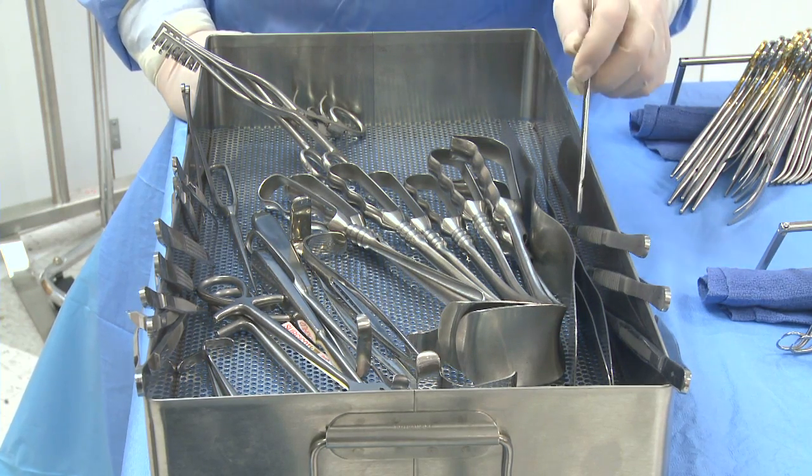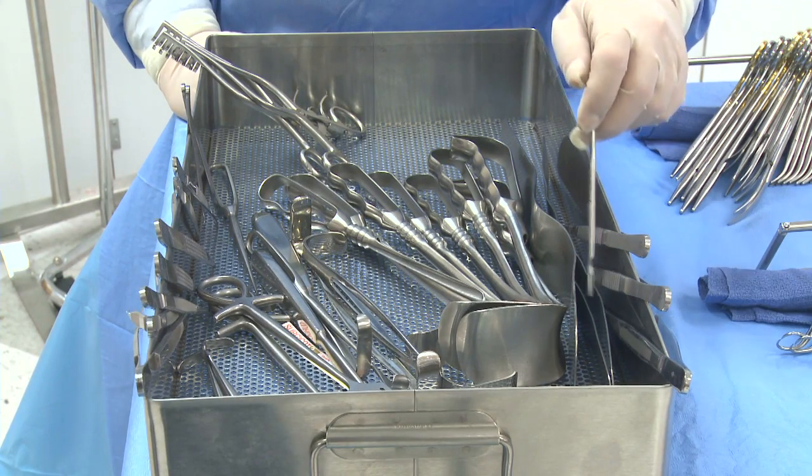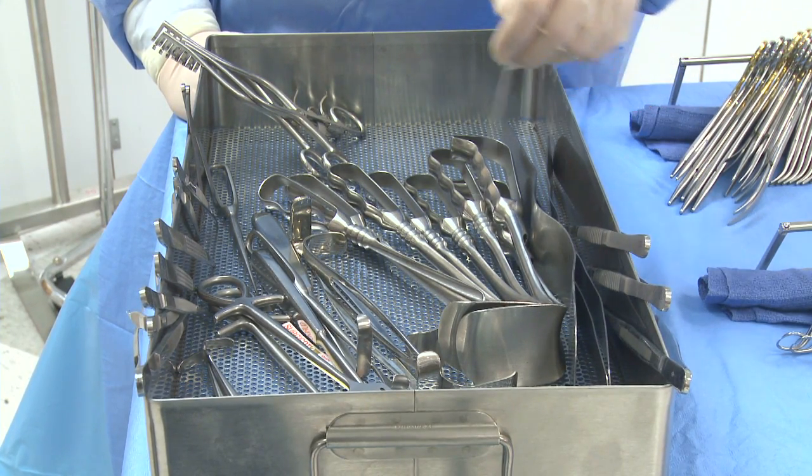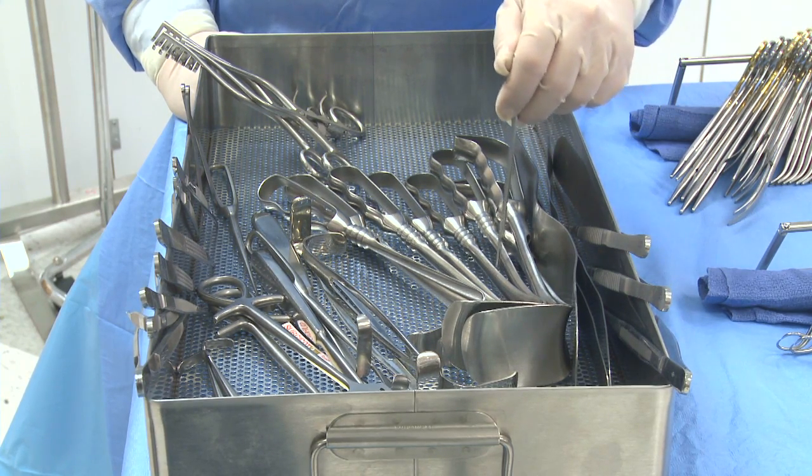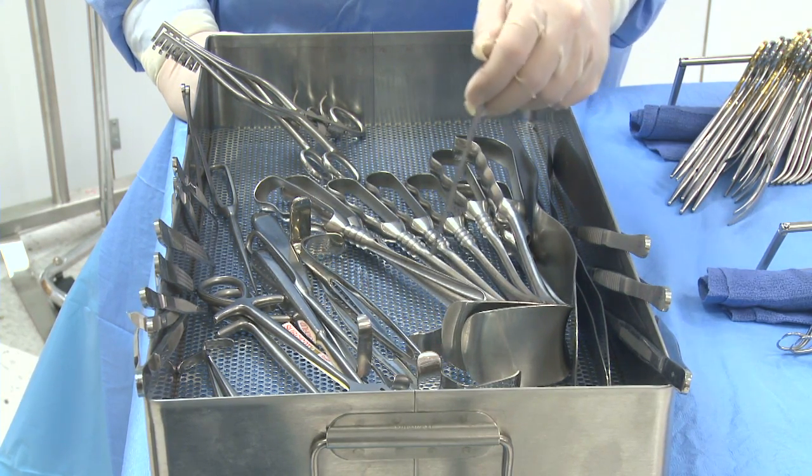Next we're going to count the retractors. You count the malleables separately: 1, 2, 3. You count the right angles as a group: 1, 2, 3, 4, 5, 6, 7, 8.